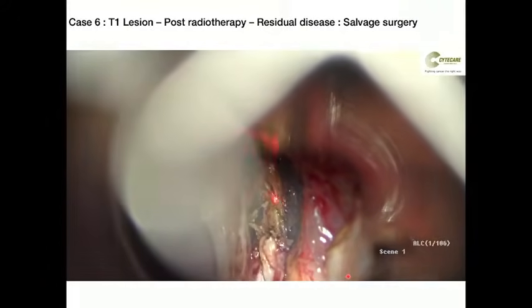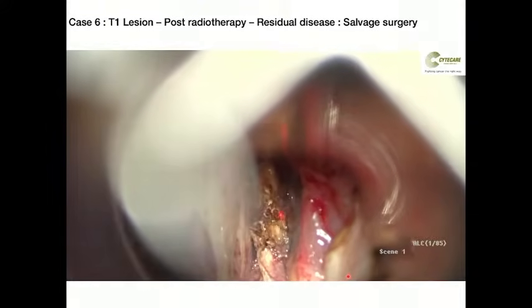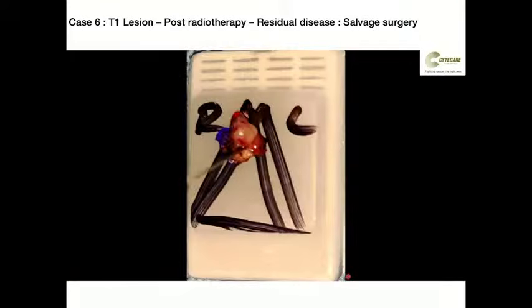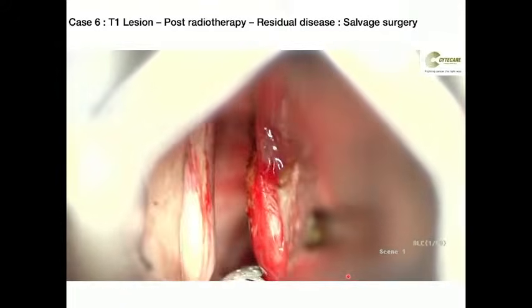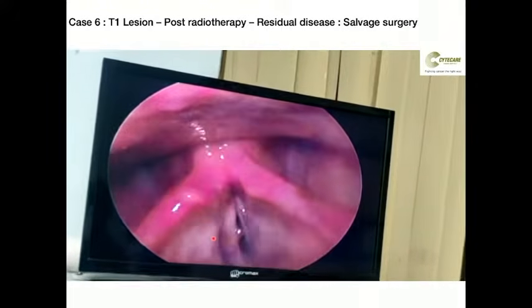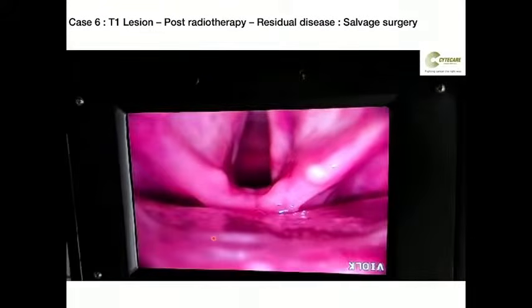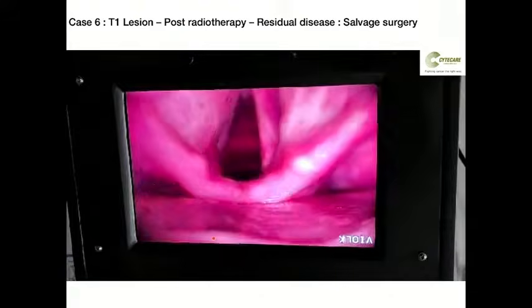So when you have larger lesions, we don't shy away from doing false cord resections, right? Many of my laryngology friends say don't disturb the false vocal cord, but I don't see any difference in functional outcomes. So my threshold for resection of the false cord is very limited, and I closely follow Professor Peretti, Professor Piazza, Carsten, my mentor. The Europeans are proponents, even in T1A vocal cord, they would excise the entire false cord, and I am also starting to do that now, and there is no difference in outcomes. So we wouldn't shy away from resecting the false cord, especially in the anterior part of the anterior third. Otherwise, we won't get the third-dimension resection or go up to the thyroid perichondrium for resection.